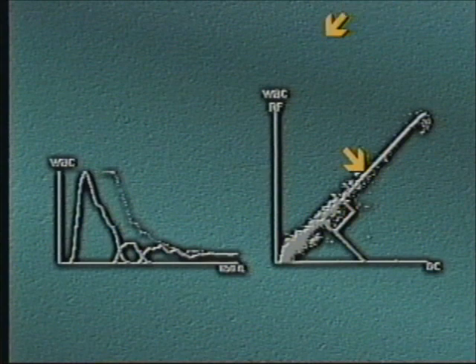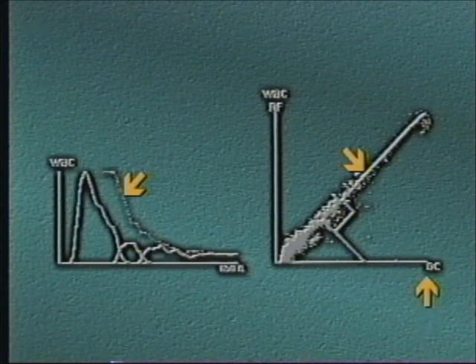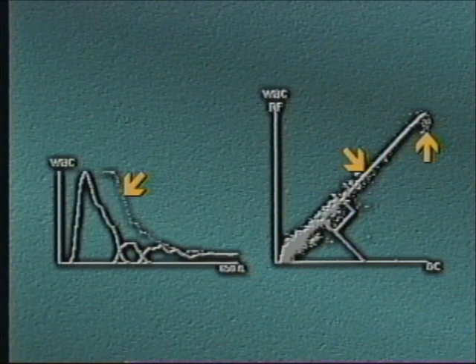The histogram display reflects this interference. The discriminator shift due to the interference is significant. On this type of instrument, clumps or clusters of cells and giant cells will appear in the upper right area of the scattergram, as well as the far right slope of the histogram.